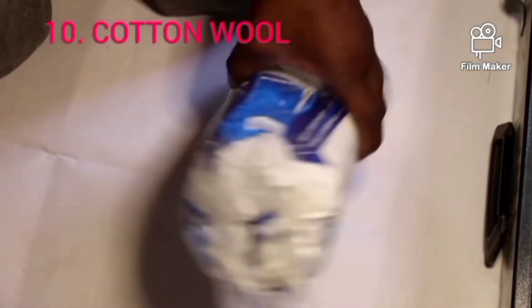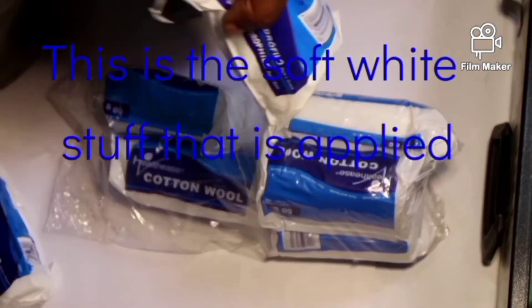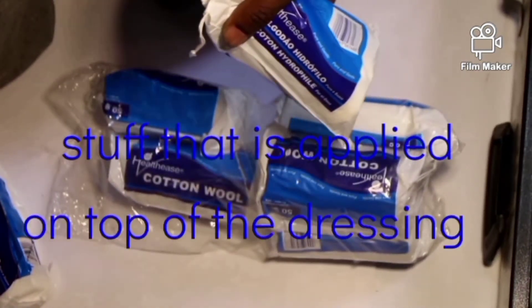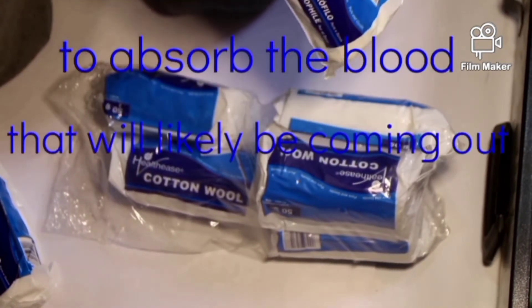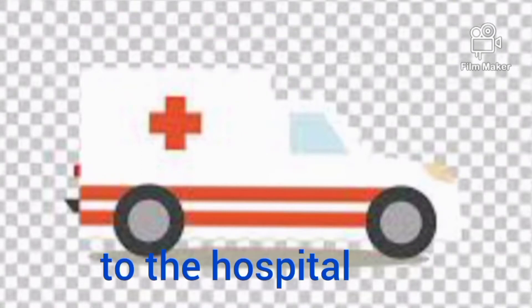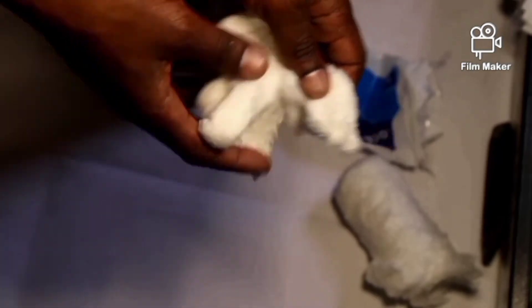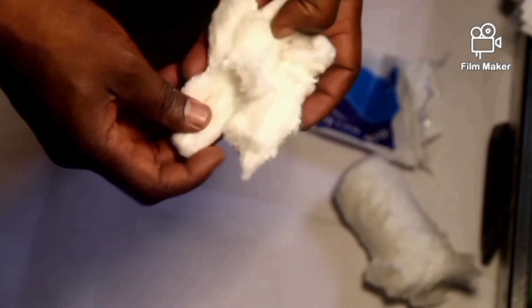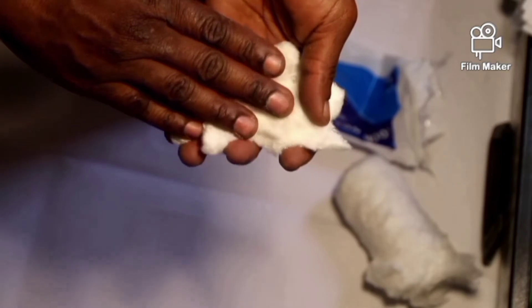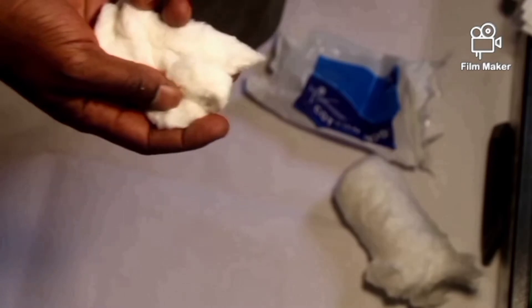Item number 10 is the cotton wool, in a total amount of 400 grams. This is the soft white material that is applied on top of a dressing to absorb the blood that will likely be coming out as we transport our patients to the hospital. You can see it is very soft. We apply it on top of a dressing after we dress the wound, so that any blood still coming out will be absorbed by the cotton wool.